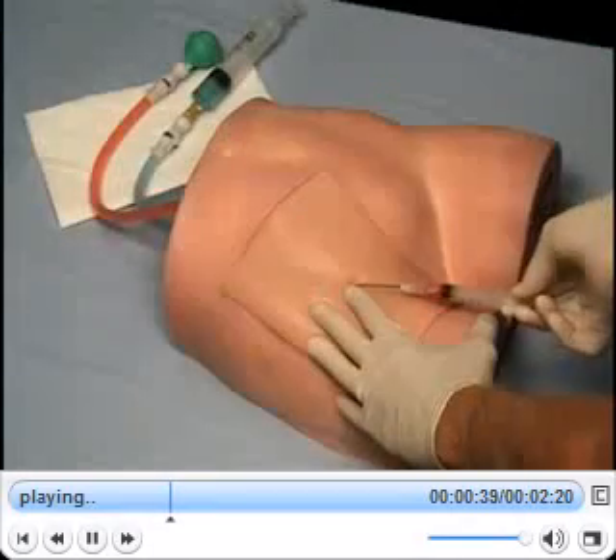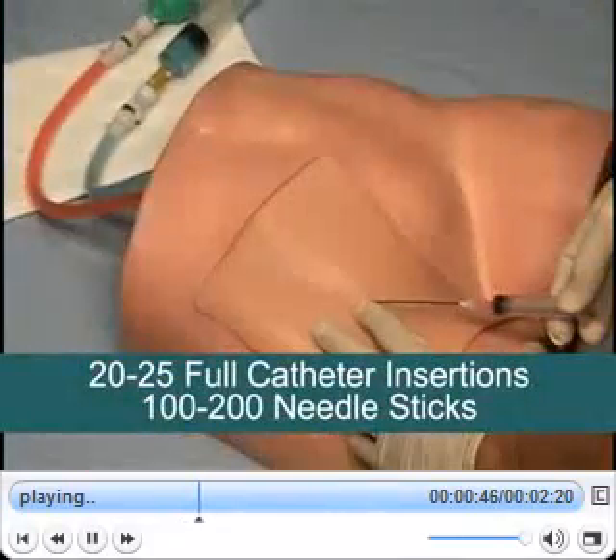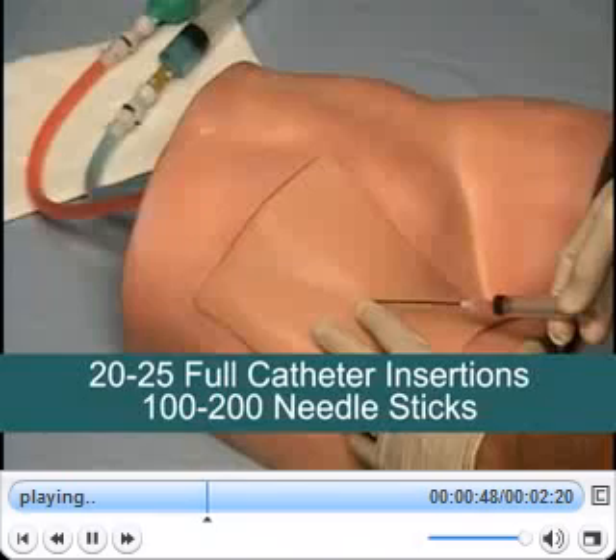Like central lineman, femoral lineman is also easy to maintain, and each replaceable tissue should last for approximately 20 to 25 full catheter insertions or 100 to 200 needle sticks.